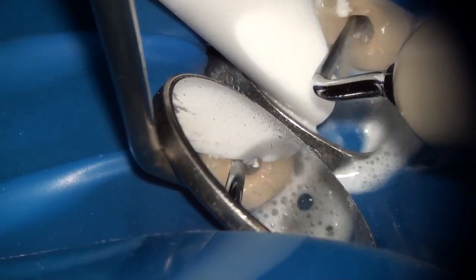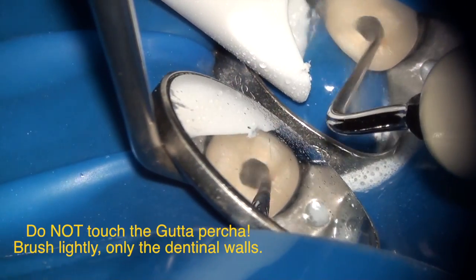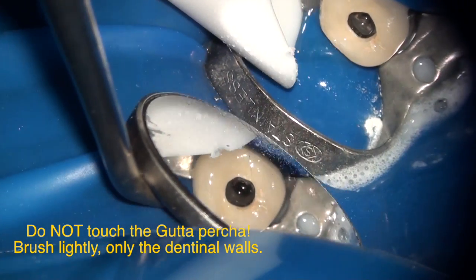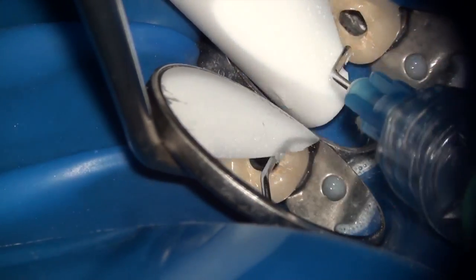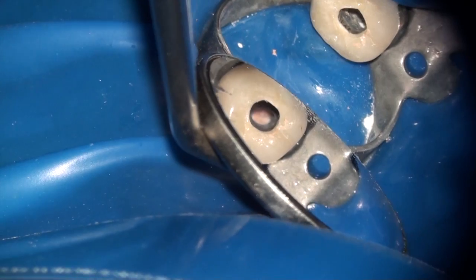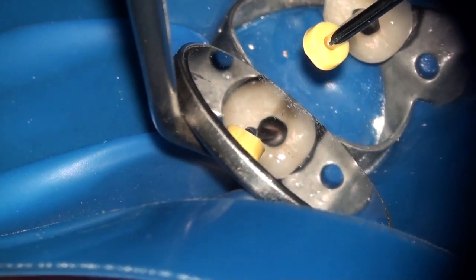The ultrasonic is then used with a size E14D tip. As you can see, within 10 seconds all of the sealer is removed from the canal walls. By walking your condenser along the side walls and perimeter of the canal, you also ensure that none of the sealer is potentially washed out from the sides of the gutta percha where the seal is present.